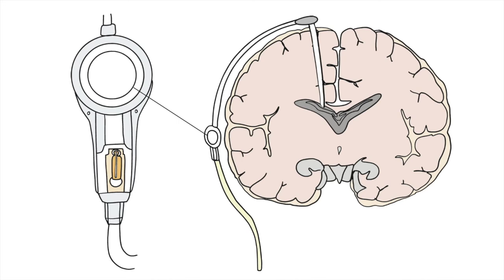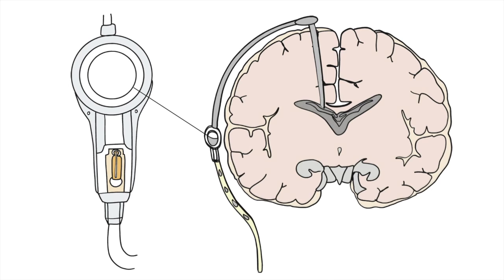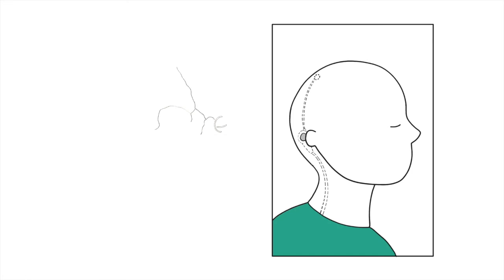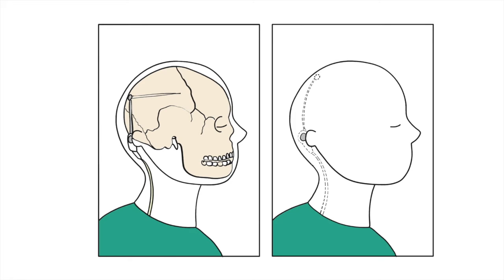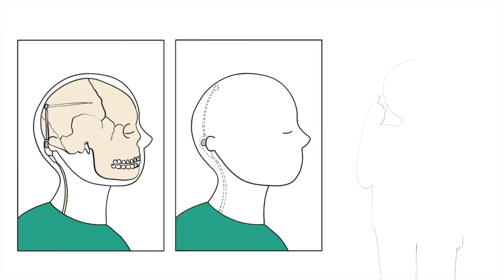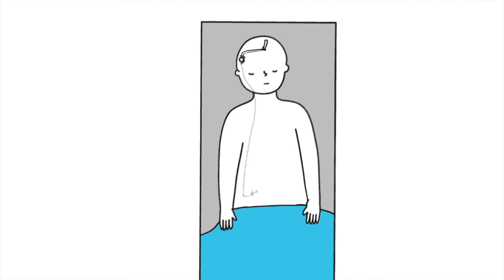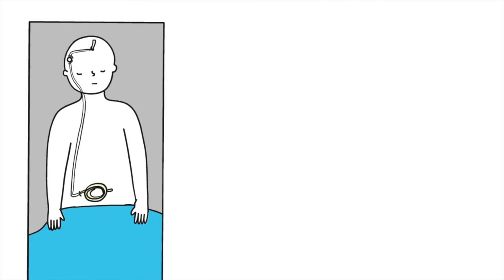This pressure-regulated valve prevents the shunt from overdraining the spinal fluid in the head and only allows the spinal fluid to flow through the shunt when the pressure in the brain gets above a certain point. This valve sits under the skin with the remaining catheter and rests on top of the skull. It will not be directly visible, but may feel like a small bump on the skin surface. This valve is then connected to another catheter that is passed under the skin to the abdomen, where it is passed into the peritoneal cavity.